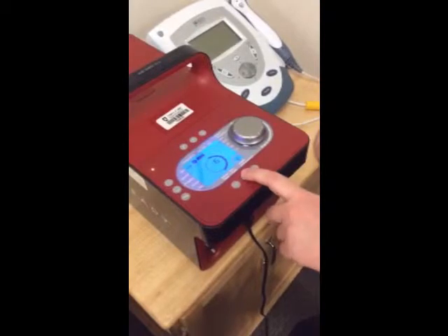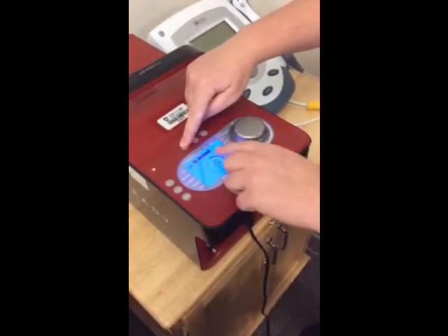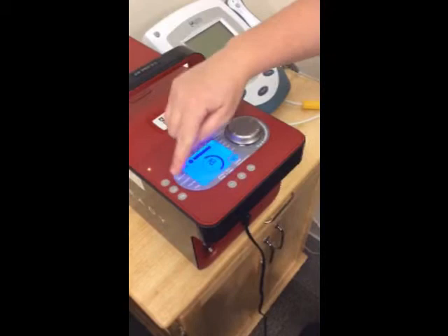Select the desired treatment time by pushing the up and down arrows, select the desired pressure of the treatment by pushing the needle button, and change the temperature of the water flowing through the sleeve by turning the knob towards or away from the snowflakes. For an upper extremity treatment, the desired pressure should be between 40 to 60 millimeters of mercury, which is either the medium or high pressure setting.